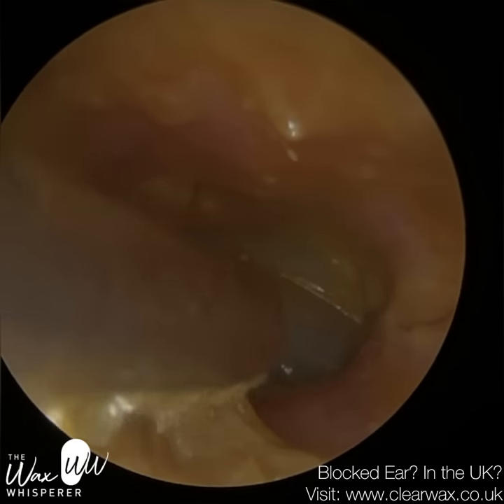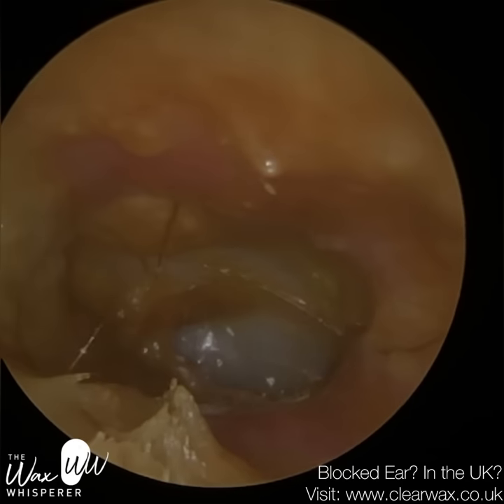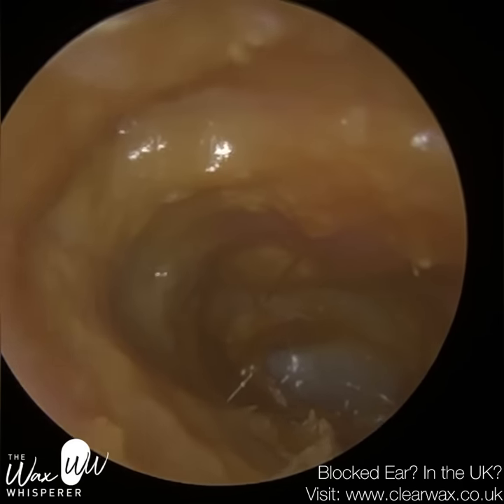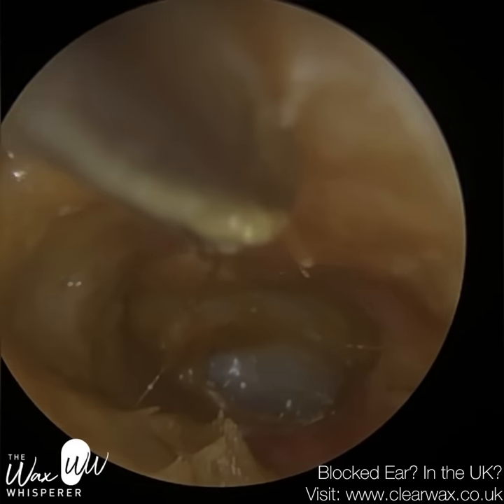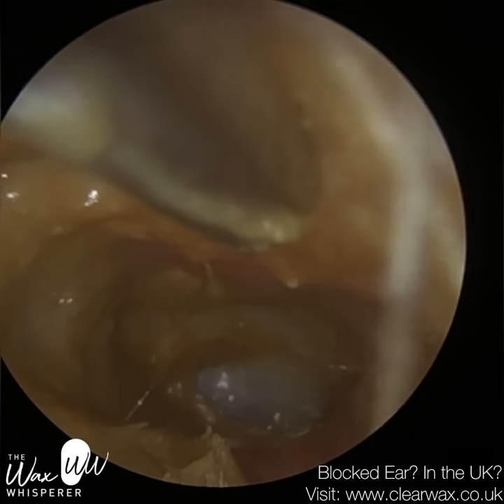By the looks of it, it's going to be every six months — biannually. I've just bent the fine end suction probe in such a way where I'm almost gliding across the canal wall without the tip penetrating or protruding towards the surface of the canal wall.